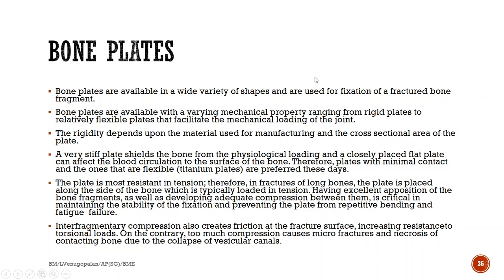You have to make sure that the bone fragments are totally supported by the plate, as well as there is adequate compression between them, because that would ultimately result in optimal load bearing in your implant, which in turn would increase its life. If there is irregular load bearing in the implant, or if the implant is subjected to bending, then that would result in implant failure ultimately, right? Interfragmentary compression will create friction on the fracture surface, and that would increase the resistance to torsional load.